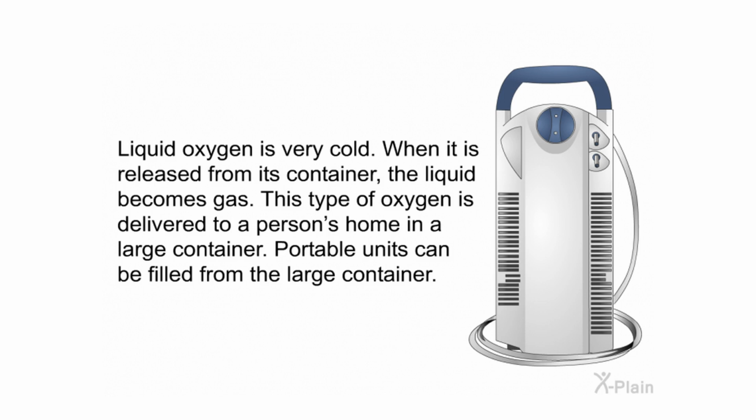Liquid oxygen is very cold. When it is released from its container, the liquid becomes gas. This type of oxygen is delivered to a person's home in a large container. Portable units can be filled from the large container.